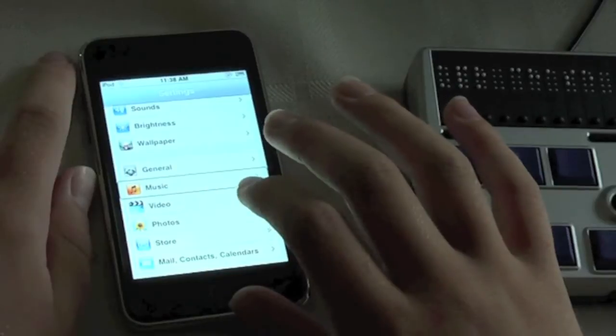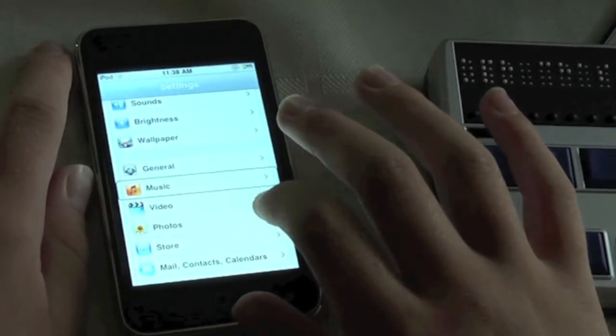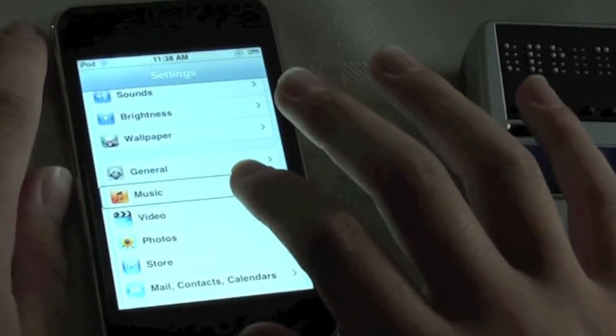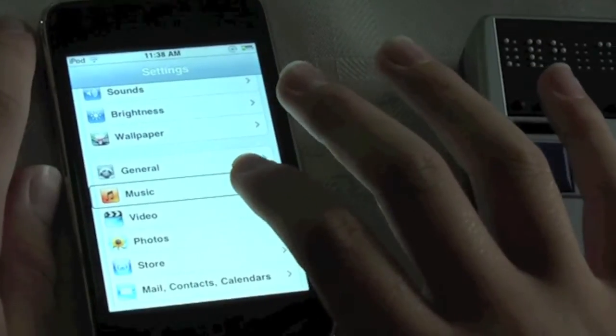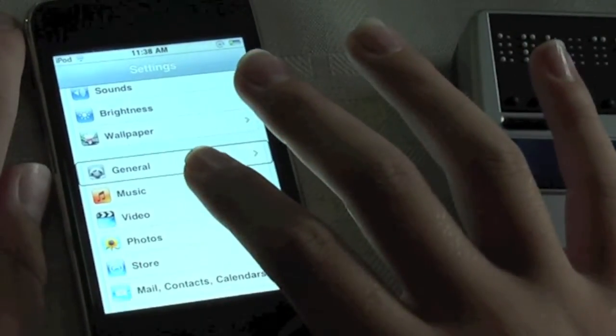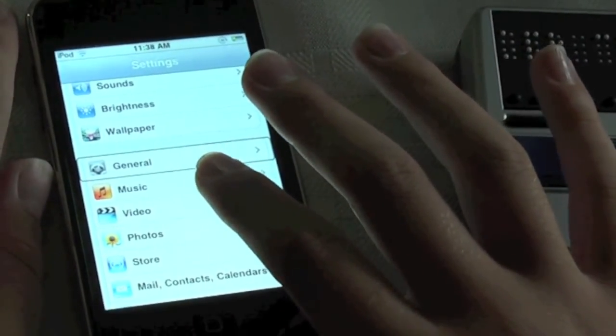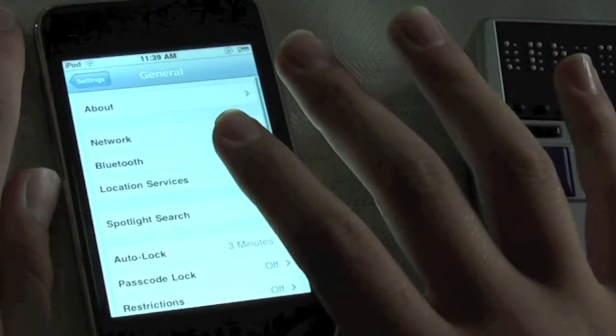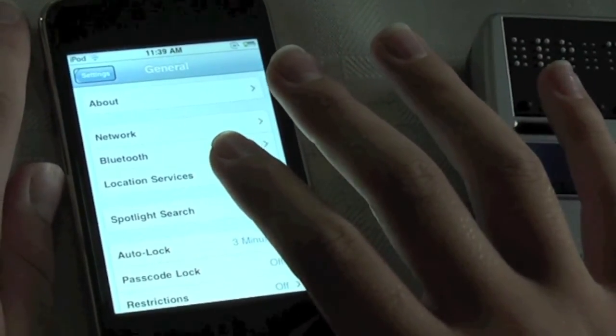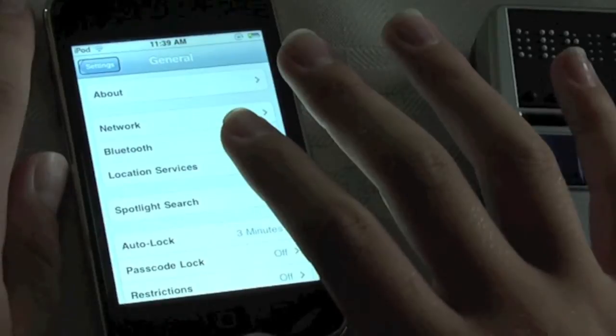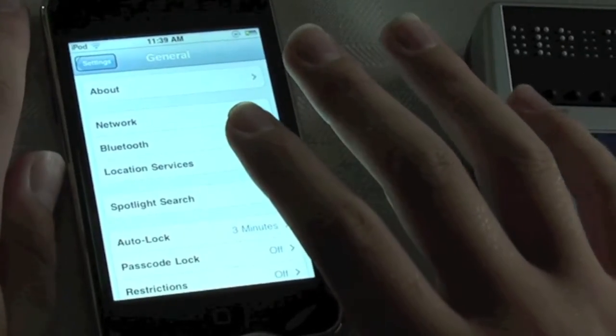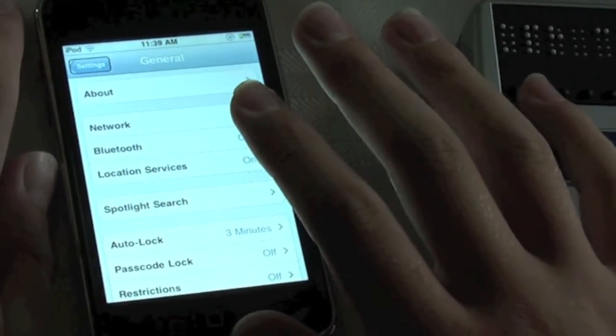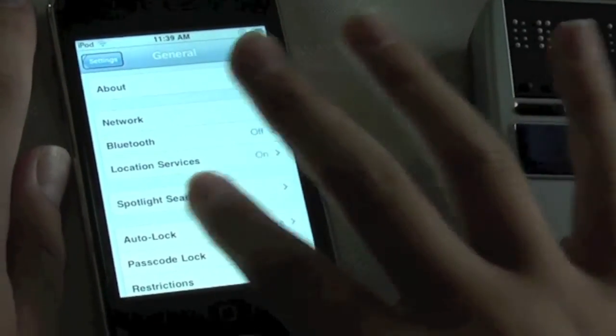Now my cursor was placed on the music item in settings but I'll flick left to General and that's where we need to go. I double tapped. And now we need to go to Accessibility which is where you can set all the iPod and iPhone's accessibility features.